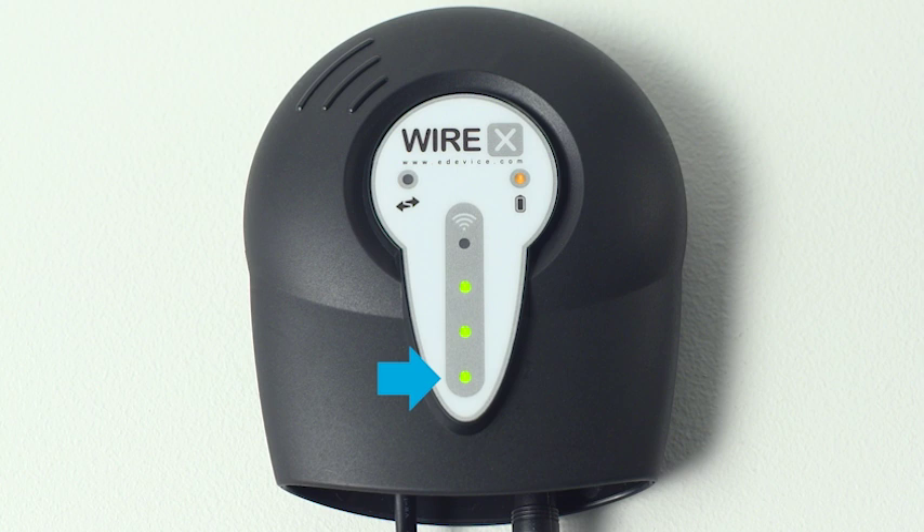The lights in the gray strip indicate the strength of the cellular signal your accessory is receiving. If you do not see a light after plugging the unit into the wall, check your connections, making sure the power cord is pushed all the way into the back of the accessory.